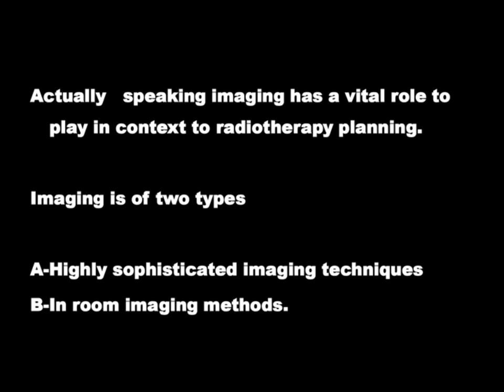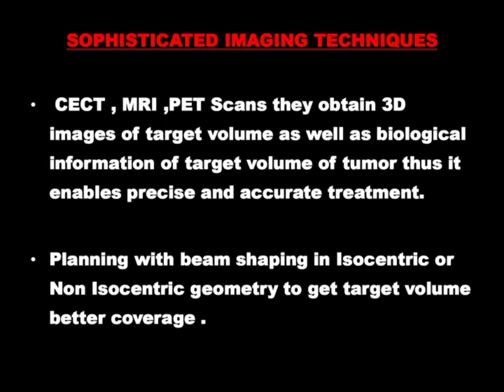You see here in head and neck cancer patients, when you contour the primary tumor and the organs at risk also, you can understand the dose deposition to that area. The dose coverage to the critical organs should not be more than what is required as per the tissue tolerance dose. And then we see definitely the tumor coverage area, and then we basically align the beam's eye view after taking the DRR images.